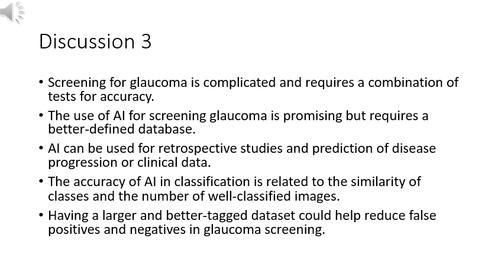The use of AI could decrease the costs of screening tools in the near future, allowing mass screening for retinal disease in the general population and not just in known diabetics. The incidence of AMD and glaucoma is currently increasing around the world. These two diseases are the second and third most frequent causes for visual impairment in Europe 32, which is why we based our research on them.